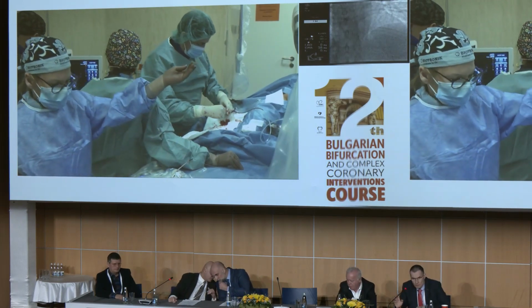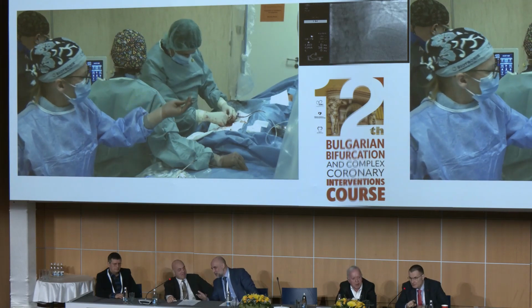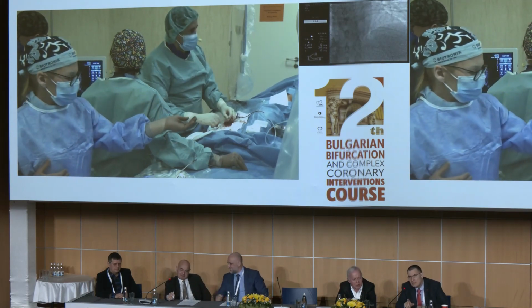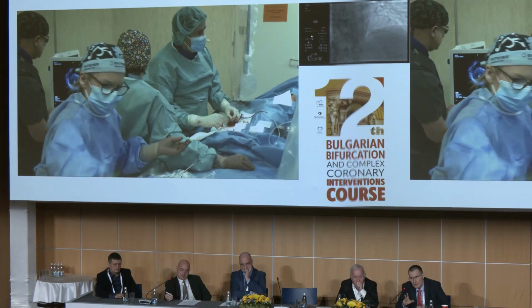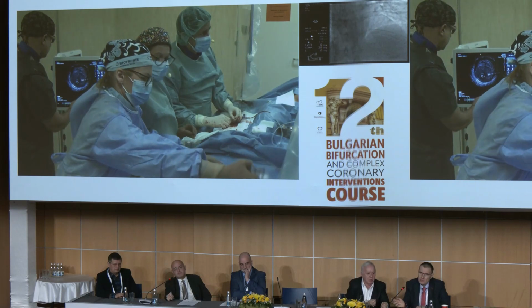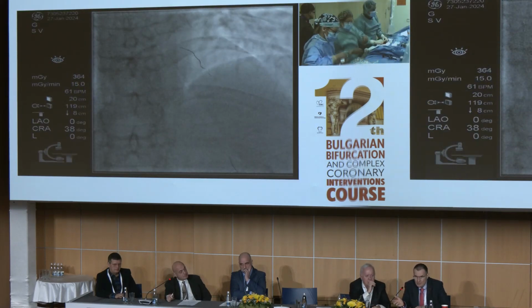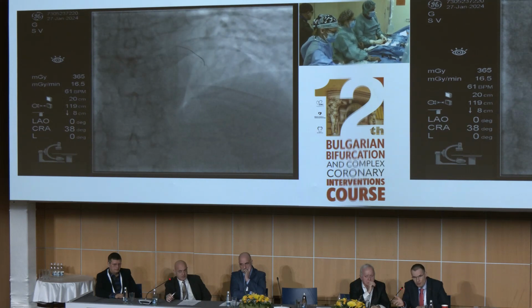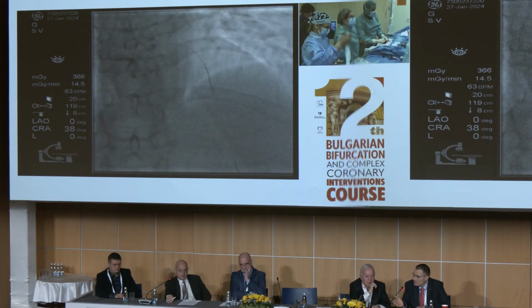Yes, 40 will be too big now because the lumen is 3.25 to 3.77. So at the mid it's 3.5, as a mean value between the two. So 3.5 will be good for the POT. Otherwise, if we follow media to media, in this case this could occur, a lot of problems.